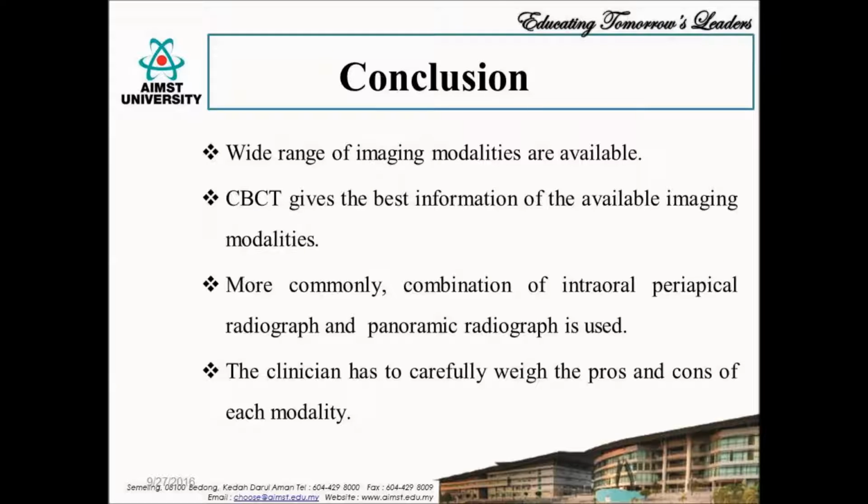To conclude, today's clinician has a wide array of diagnostic tools at his disposal. The CBCT gives the best information of the available imaging modalities. More commonly, though, a combination of intraoral periapical and panoramic radiographs is used. To date, no modality has been deemed to be perfect.